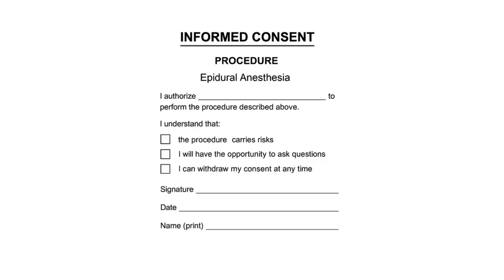When the patient indicates they are ready for an epidural placement, first ensure that informed consent has been obtained, confirm that a brief history and physical examination have been documented, and that recent lab results have been reviewed. Gather all necessary supplies, including the epidural kit, PPE, emergency airway equipment, and medications for potential complications. Additionally, verify that the patient has a functioning IV line with fluids infusing.